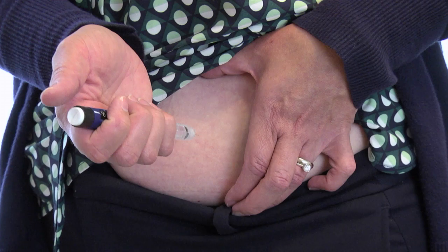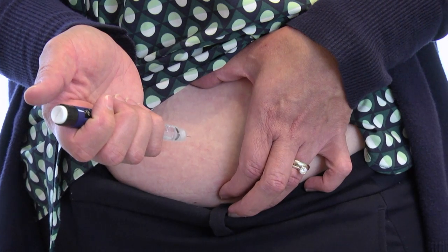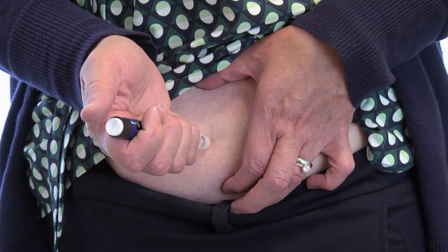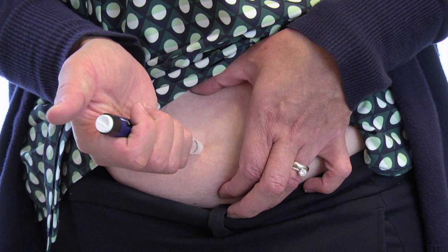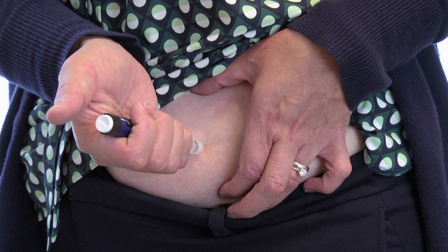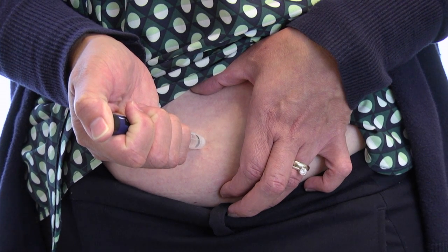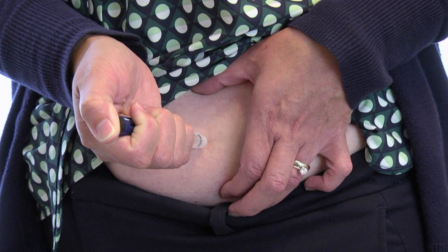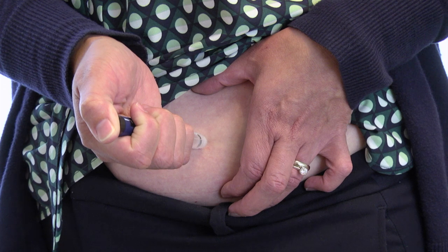Using the hand you write with, wrap your fingers around the insulin pen, keeping your thumb free to push down on the knob. Insert the needle with a quick motion into the skin at a 90-degree angle. The needle should go all the way into your skin. Slowly push the knob of the pen all the way in to deliver your full dose. Remember to hold for six to ten seconds, and then pull the needle out.